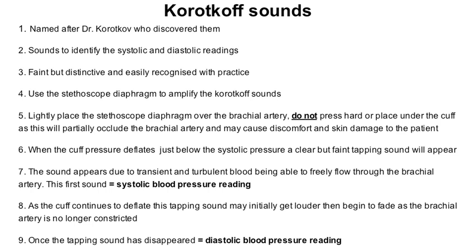The Korotkov sounds were named after Dr Korotkov who discovered them. These sounds are used to identify the systolic and diastolic blood pressure readings — they are often faint but distinctive and easily recognisable with practice. Use the stethoscope's diaphragm to amplify the Korotkov sounds. Lightly place the stethoscope diaphragm over the brachial artery. Do not press hard or place the stethoscope under the cuff, as this will partially occlude the brachial artery and may cause discomfort and skin damage to the patient. When the cuff pressure deflates just below the systolic pressure, a clear but faint tapping sound will appear due to transient turbulent blood freely flowing through the brachial artery — this first sound is your systolic blood pressure reading. As the cuff continues to deflate, this tapping sound may initially get louder then begin to fade. Once the tapping sound has disappeared, this is the diastolic blood pressure reading.